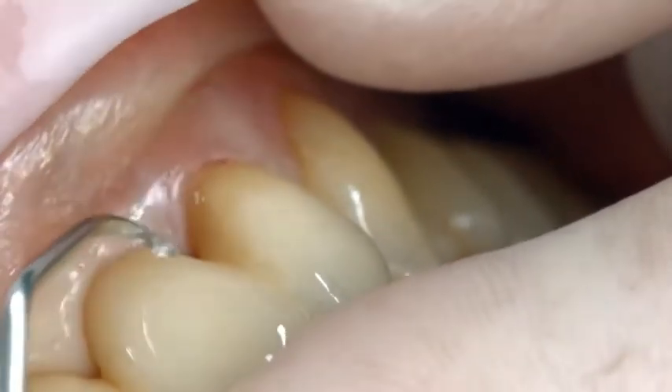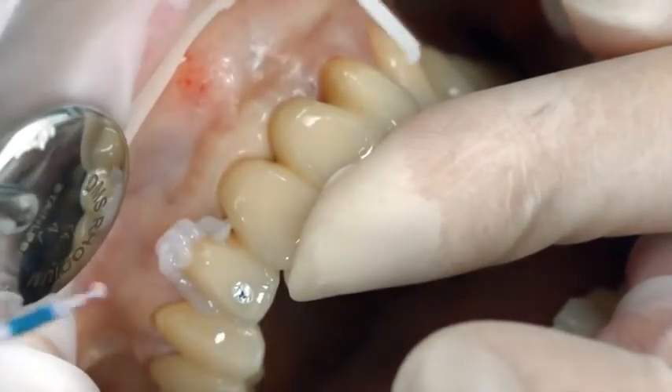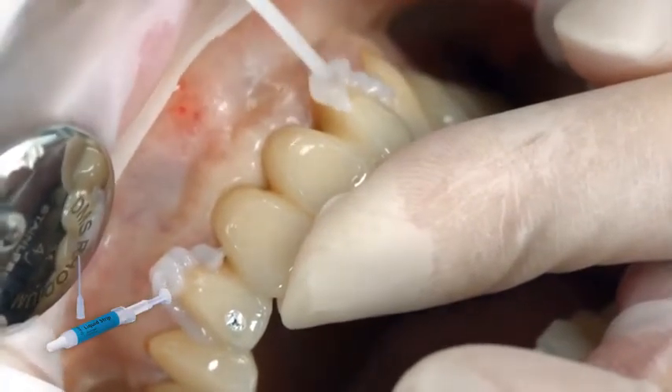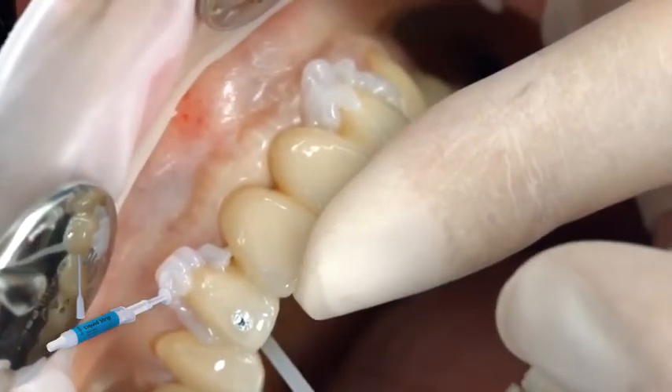The gel-like excess can be easily removed with a scaler. Just like all other composite resins, Multi-link Speed is subject to oxygen inhibition. In order to counteract this effect, cover the restoration margins with glycerin gel or air block immediately after you have removed the excess cement. Liquid Strip is ideal for this purpose.